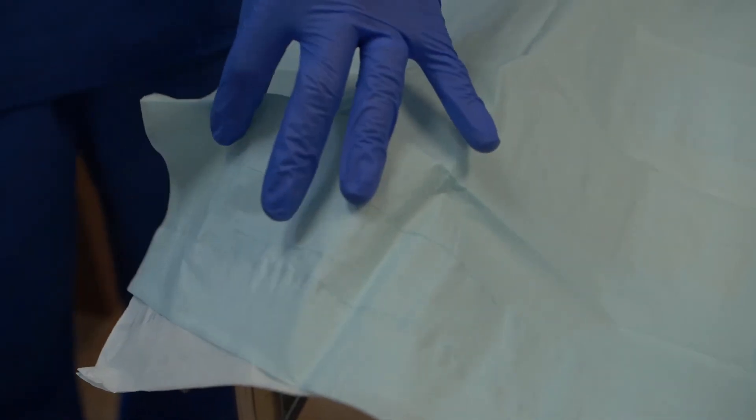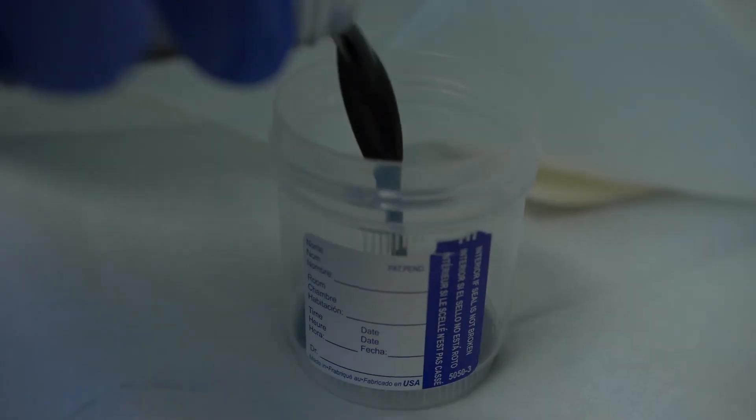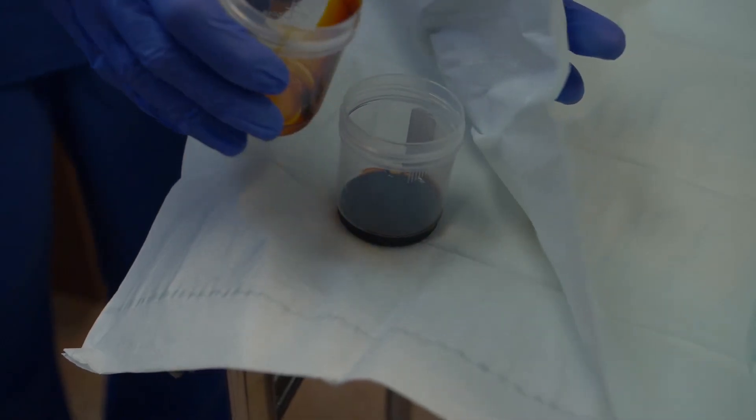Carefully pull back the upper right-hand corner of the tray cover to expose the cup. Pour the needed amount of solution into the sterile cup.